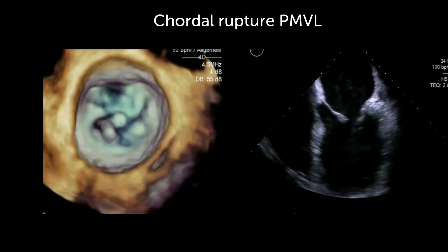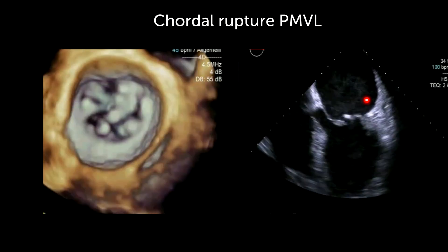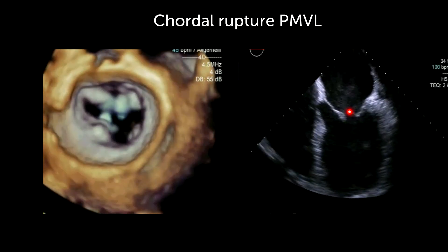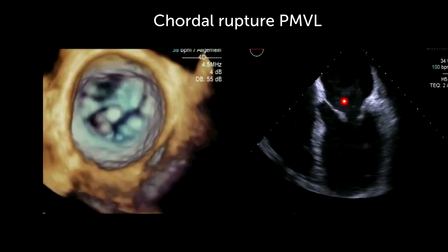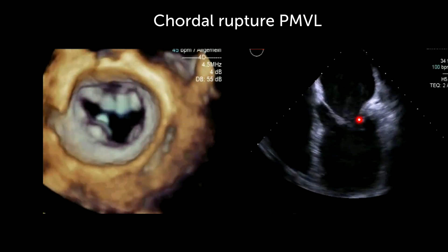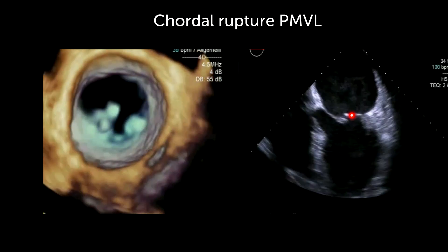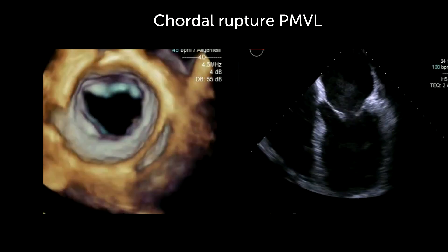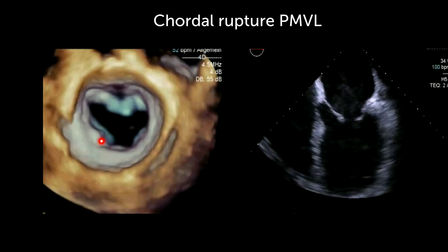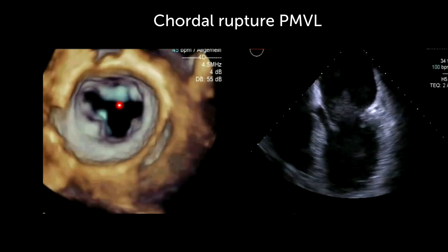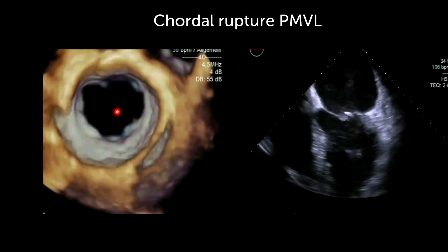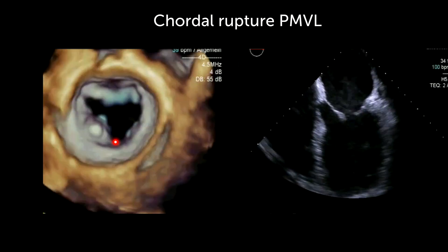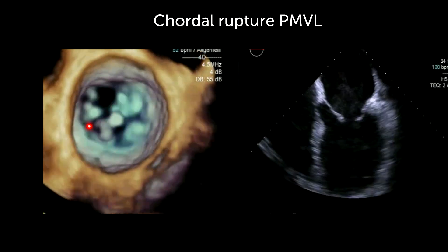What about this patient here? In the four-chamber view, there is a very small little cordial structure which is protruding into the left atrium — very difficult to detect, but truly there is a flailed leaflet here. And if you look closely, you can see that as well here in the 3D image, very nicely. Where is it located? Probably somewhere between P2 and P1, somewhere in that region here.